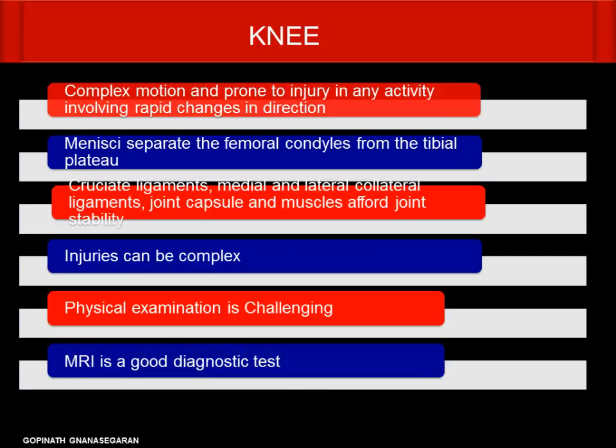So the role of SPECT CT in the knee is quite challenging because in general, for all knee pathologies, the first line of investigation will be an X-ray followed by an MR. Only when it is complicated, if the MR specialist is not sure exactly what is happening in the knee, then the role of SPECT CT is quite complementary.